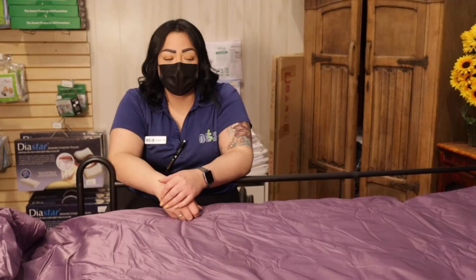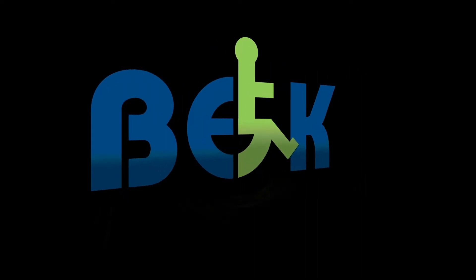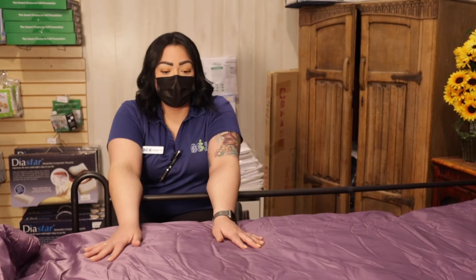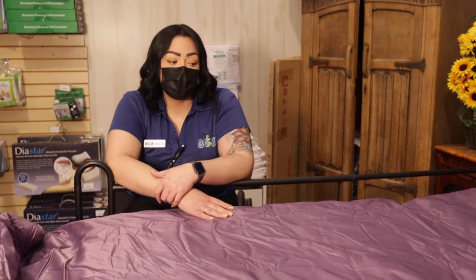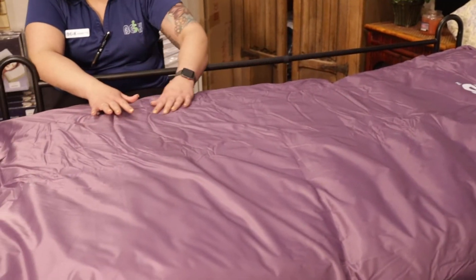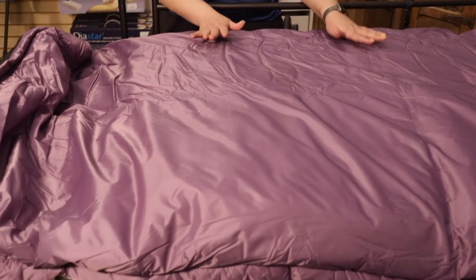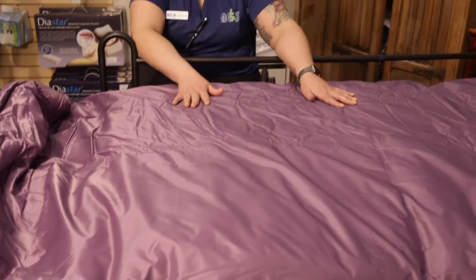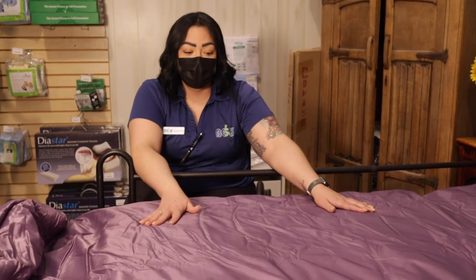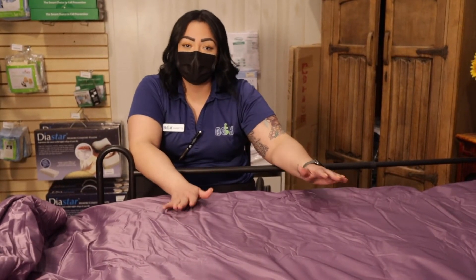Welcome back to BEK. Today we're going to be talking about another mattress — your air mattress. This is a six-inch mattress. Right now it's still inflating; it takes about 40 minutes to inflate completely. It is six inches high once it's completely inflated, and this one is going to be your alternating pressure mattress.